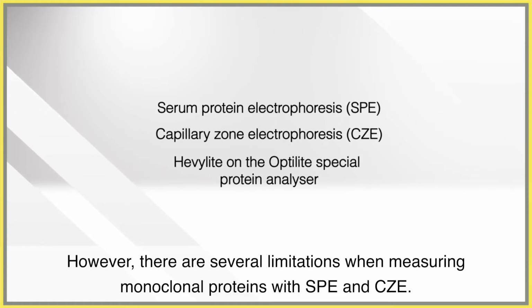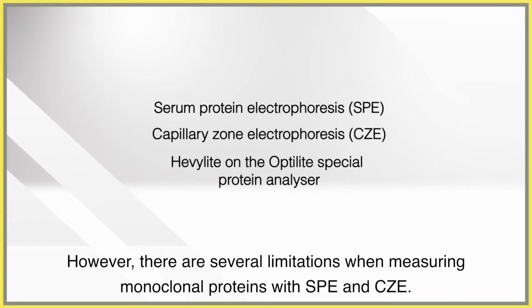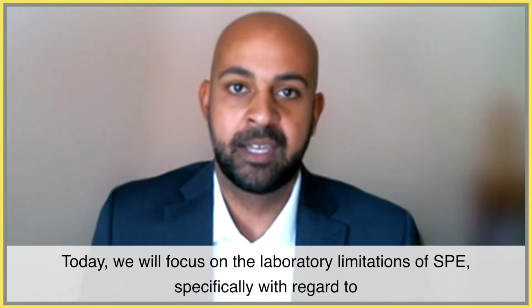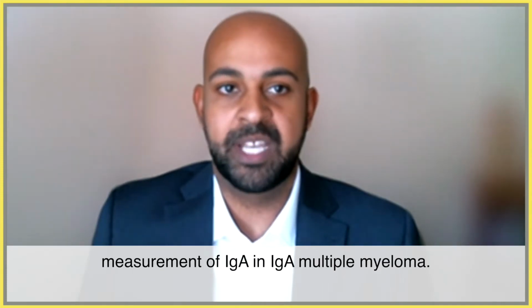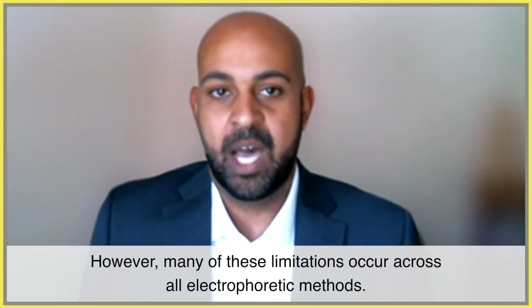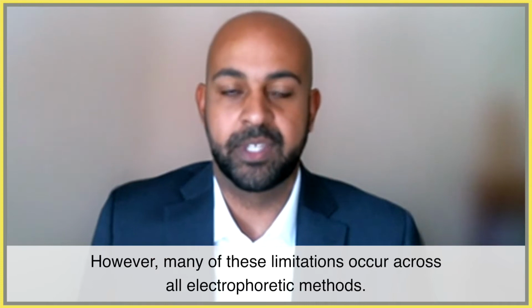However, there are several limitations when measuring monoclonal proteins with SPE and CZE. Today, we will focus on these laboratory limitations of SPE, specifically with regards to measurement of IgA in IgA multiple myeloma. However, many of these limitations occur across all electrophoretic methods.